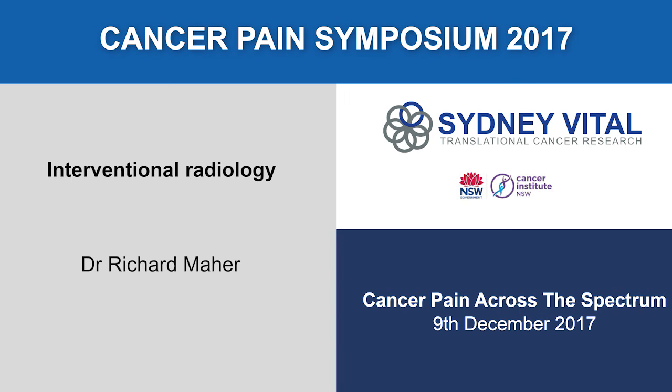We do a PET scan pre and post. PET scan is probably the best way of assessing the response because the radiation effect can be hard to assess and see on CT. So the bottom image, if you look at this, is a sagittal, axial and coronal image of the PET, and you can see how very PET avid that tumour was.